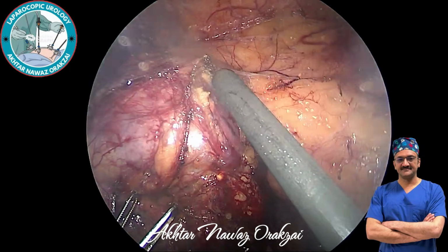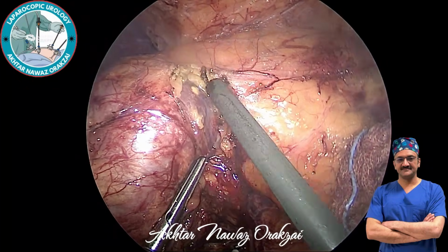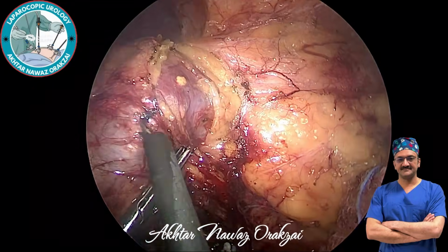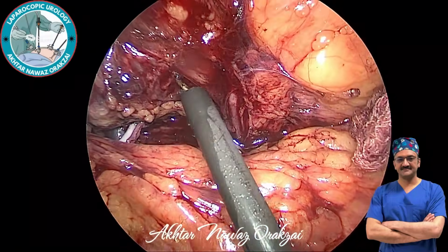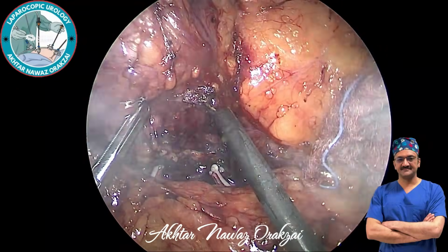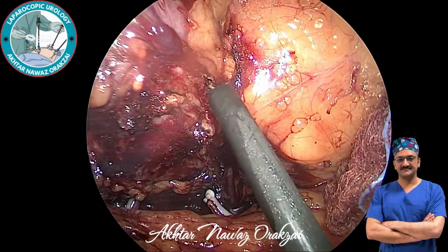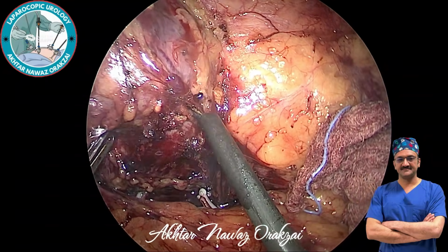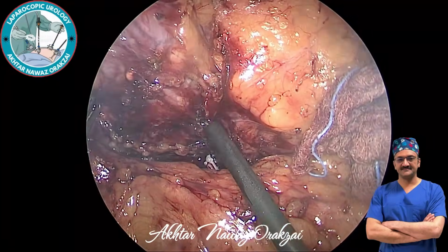This is also a very tricky dissection because at times that small artery which is arising from the upper polar artery of the kidney can get injured and can cause a bleed, and at the same time injury to the upper polar artery must also be avoided.